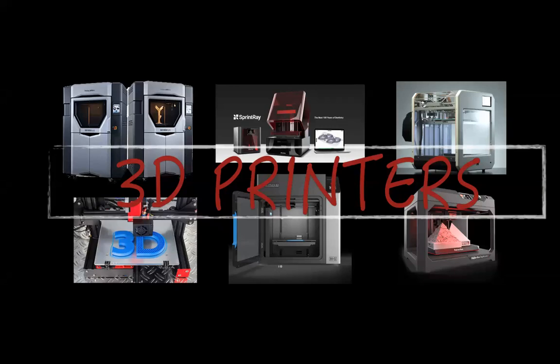If I don't have a CBCT in my office, you really do not need this equipment. This equipment is for somebody who constantly and routinely, on a day-to-day basis, does this. So I'm not suggesting that you should spend $20,000, or with a CBCT $100,000, to bring this equipment into your office because you want to create a surgical guide of $150. That's not what I'm suggesting.